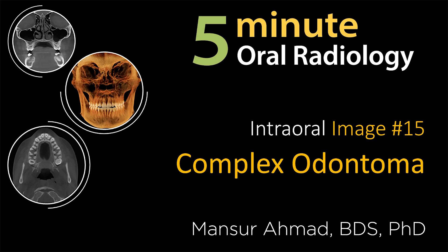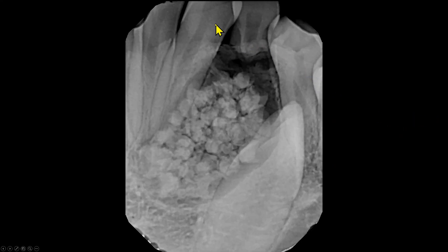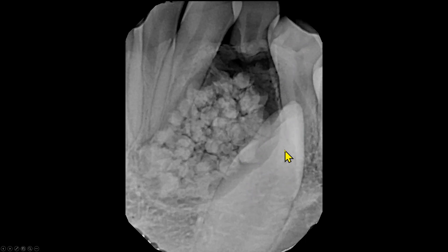Let's start with a periapical radiograph showing complex odontoma. On this periapical radiograph, this is the lateral incisor, this is the canine, and this is the first premolar. The canine is vertically impacted and distally displaced. Between the root of the lateral incisor and crown of the impacted canine, we see multiple radiopaque entities.